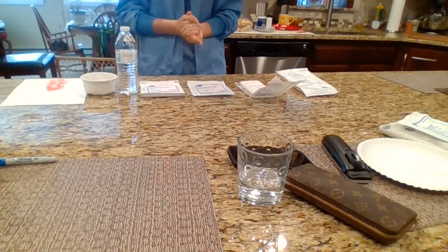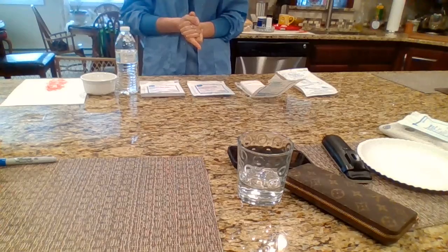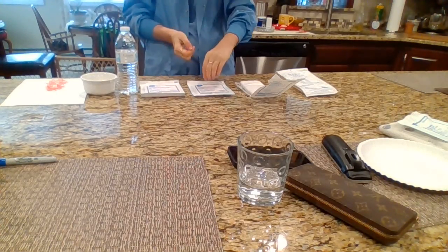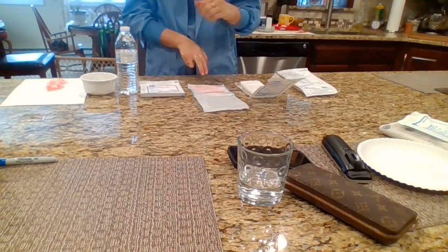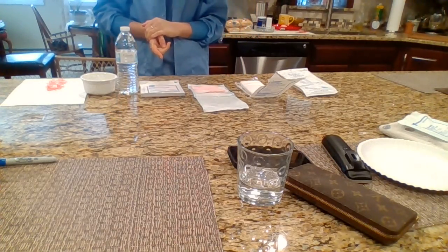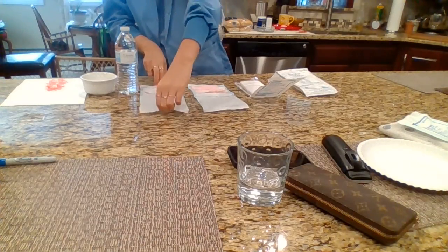And then over here I have 2 packs of gauze. This pack right here in the middle, this is what's going to be placed inside the new dressing, so I'm going to open that up. And then I have another pack of gauze. This gauze over here is what I'm going to use to wipe the wound with. I'm going to open that up.